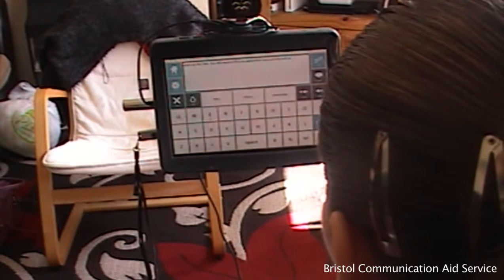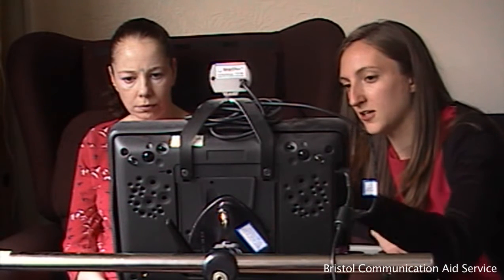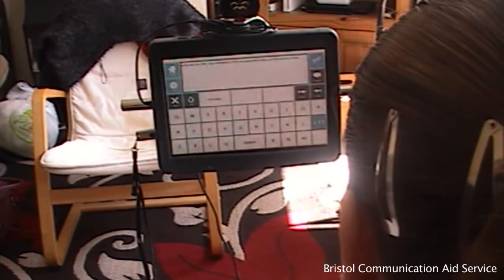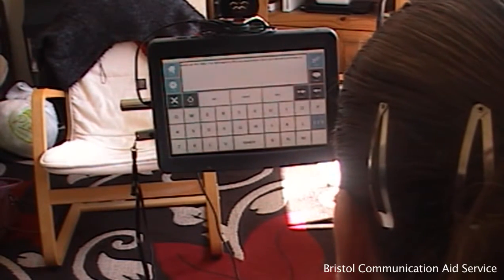A head mouse is ideal for clients who require hands-free communication. With just slight movements of the head, access to sentence building opens up a new world of personalized communication, all hands-free. The movement of the head mouse is tracked on the screen and may be used like an ordinary mouse to select icons on the device. This particular setup will focus specifically on the Smart Nav head mouse, although there are other head mouse options available.